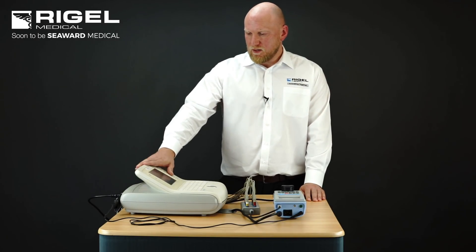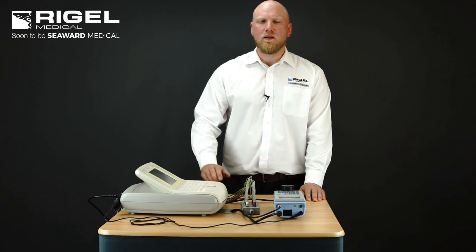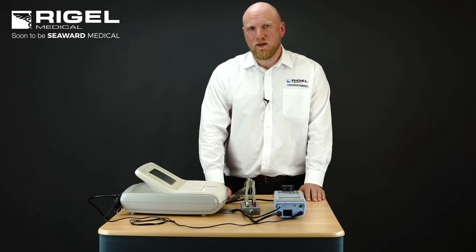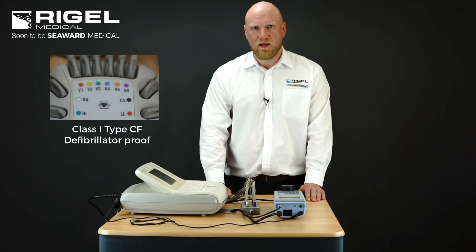We will identify the classification of the medical device — is it class 1 or class 2? We will also identify the type of the medical device — is it a type B, type BF or type CF?